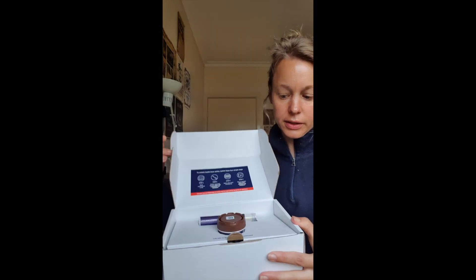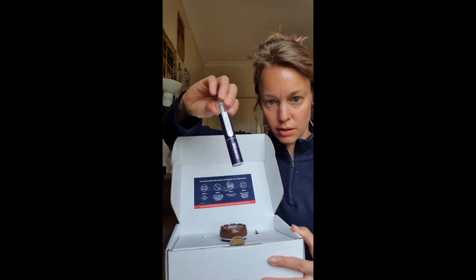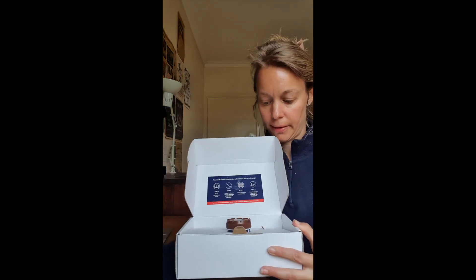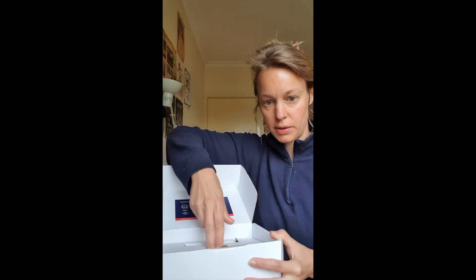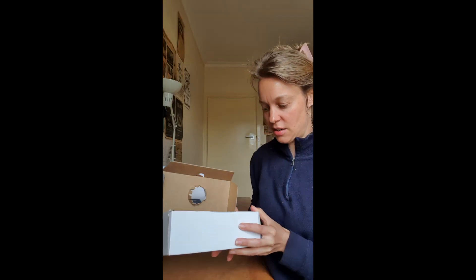Inside your kit, you are going to find your collection swab tube and your collection pot. Underneath, there's actually an ice pack. So if you haven't pre-frozen this, you'll need to stop.